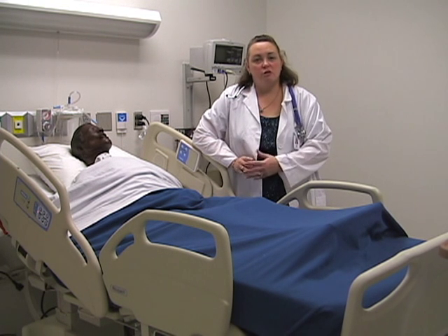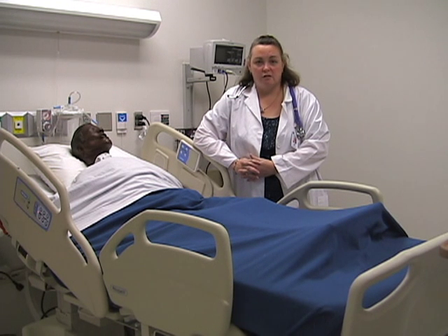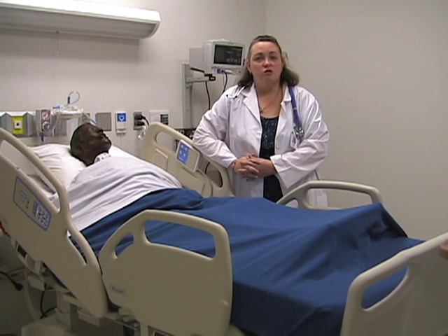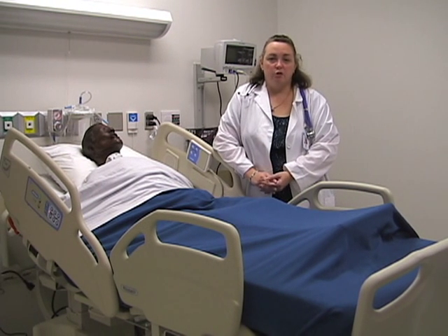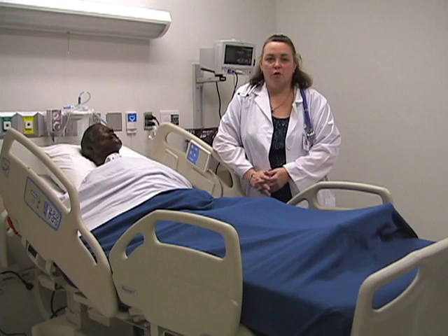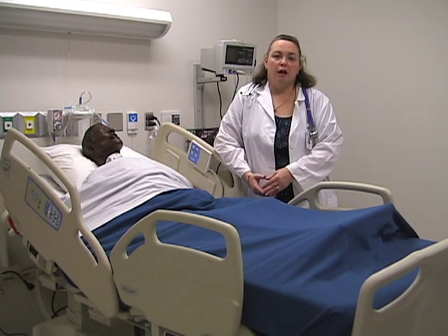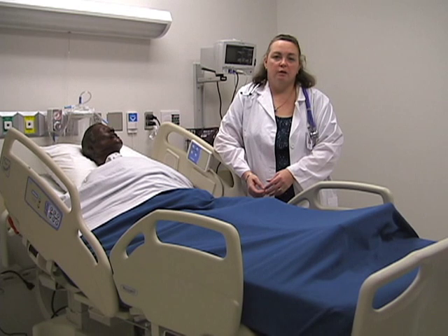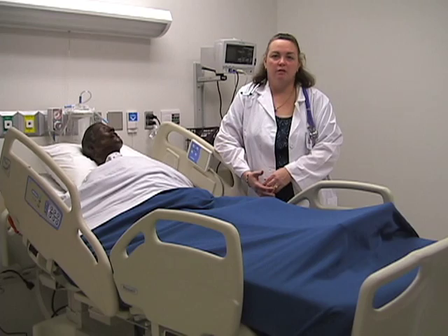When you go to perform this task, it's always important that the first thing you should do is gather your supplies and also to talk to your patient. A patient who is informed as to why we're doing the procedure, the reasons for it, and how long the procedure will be will be more compliant. It is something that you and the patient will both be interacting with, and if you're both on the same page, you're more likely to have a successful outcome.